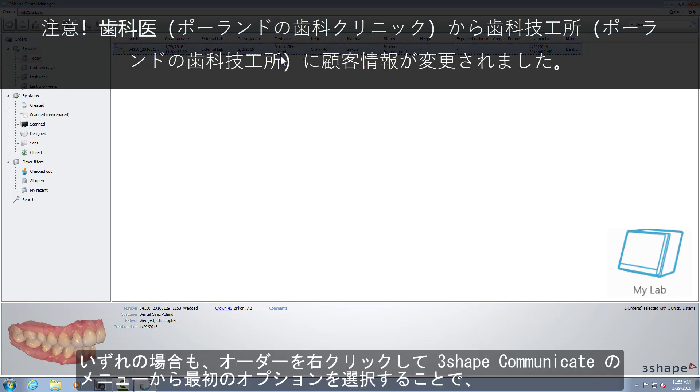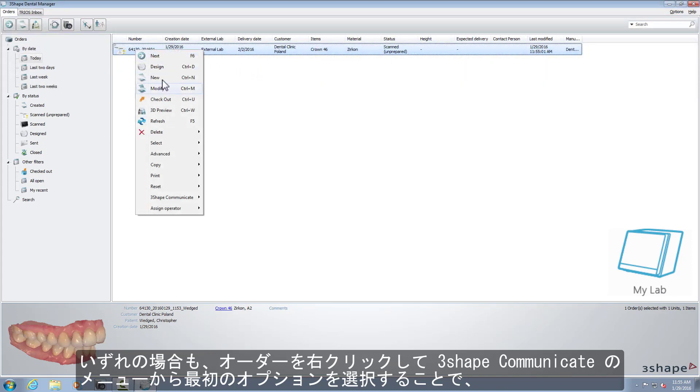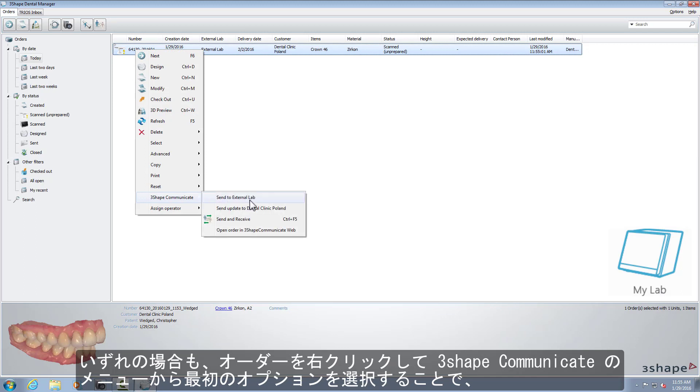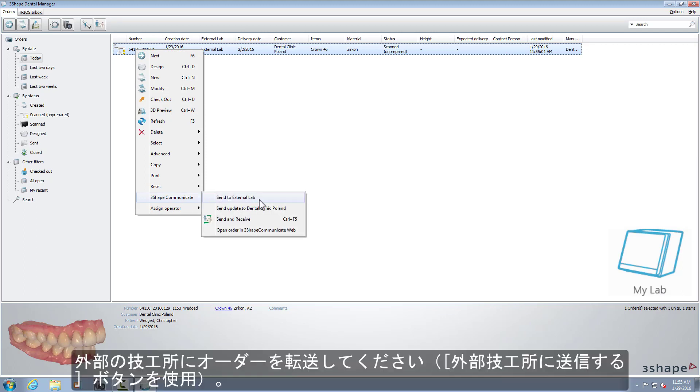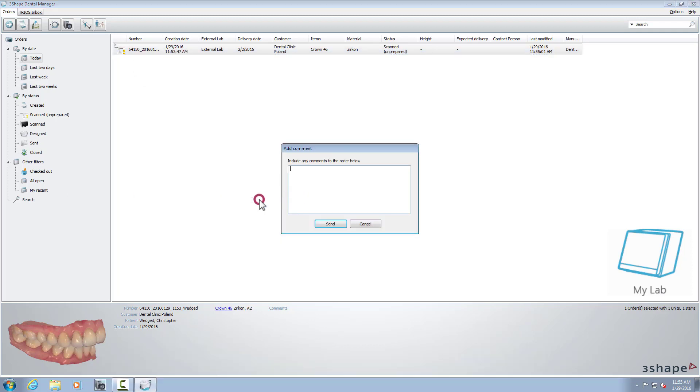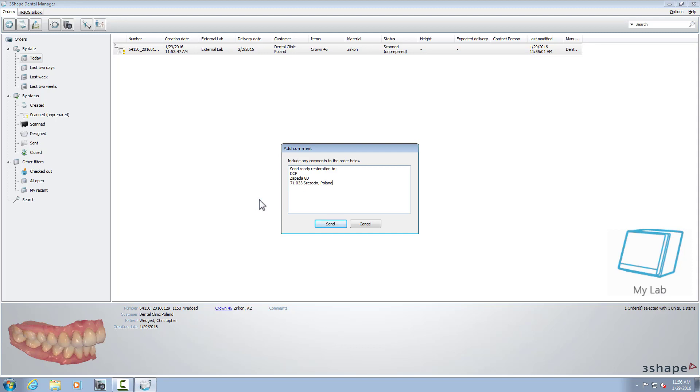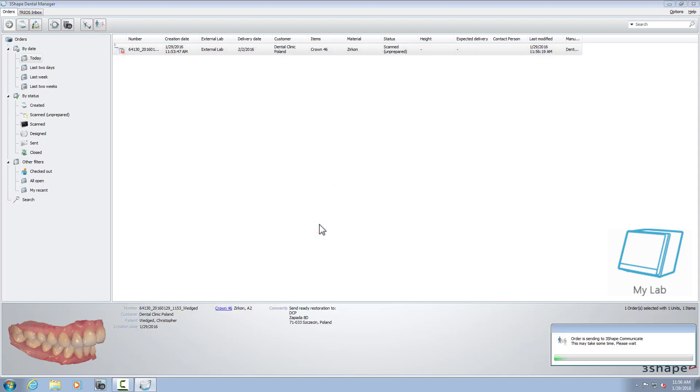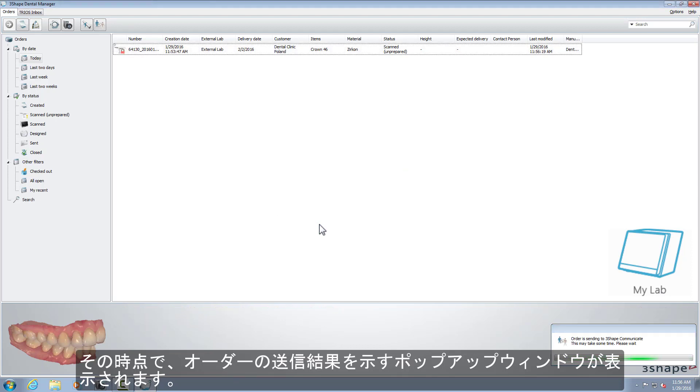In both cases, forward the order to the external lab by right-clicking on the case and choosing the first option from the 3Shape Communicate menu, which is in our case, Send to External Lab. This will be the name of the lab connection. At that moment, you will see a pop-up window with a message that shows the results of sending your case.